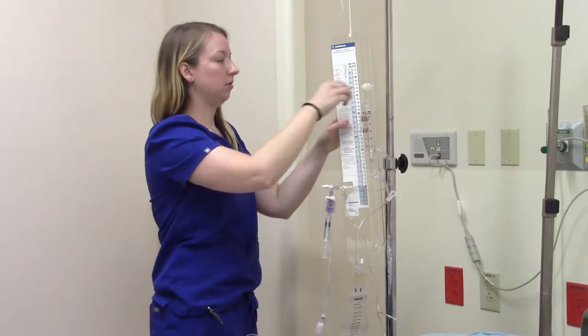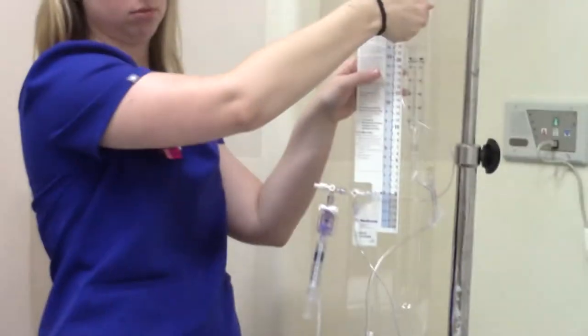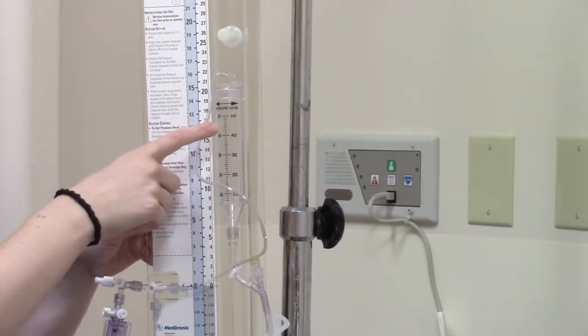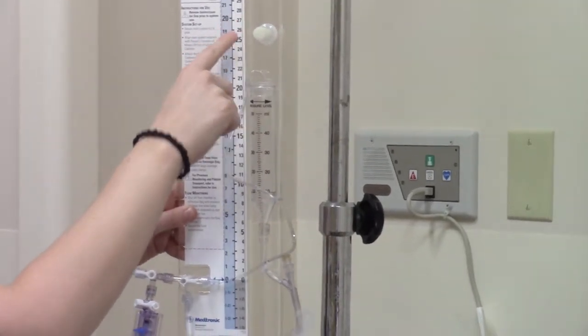This also slides up and down, and the way you release it is you turn it to the left, counterclockwise. You can adjust this up and down. The reason you'll need to do this is your neurosurgeon is going to give you a pressure measurement that they want this set up at.